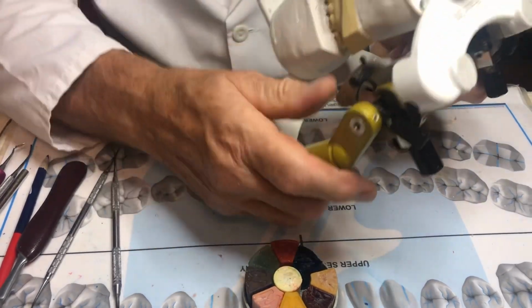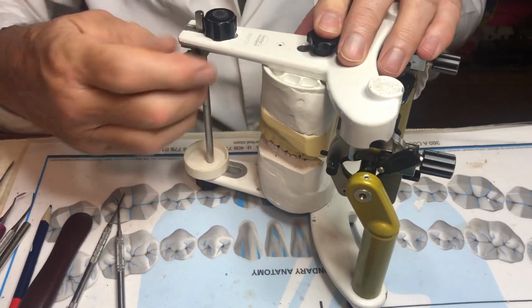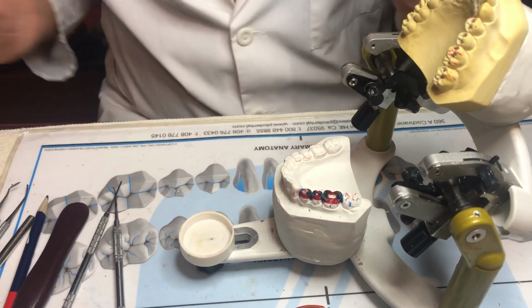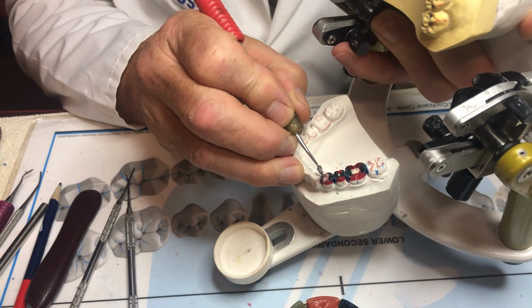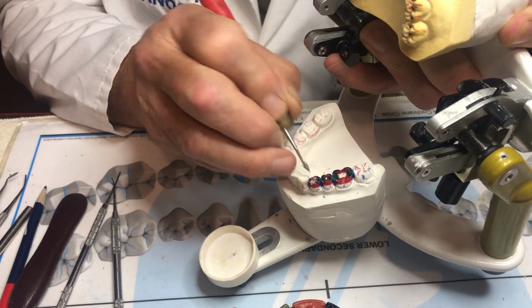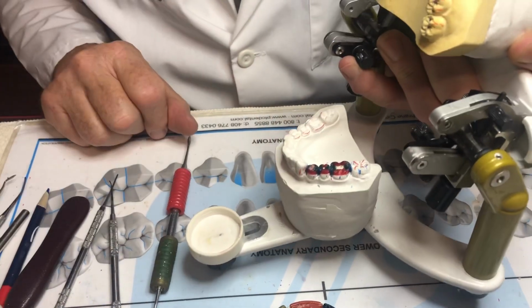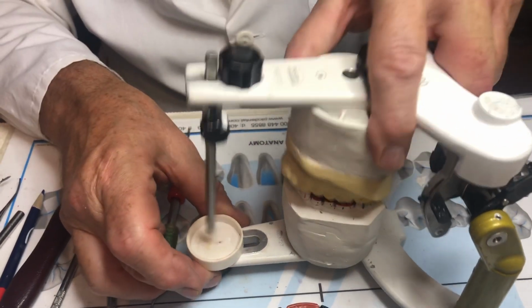Close the articulator, centric occlusion, move it in working, balancing, protrusion, and retraction. Now I have all of that. I can switch over to whatever carving instrument I have. Take a small instrument, I can come in and accentuate the secondary grooves, triangular fossa, distal triangular, central groove, lingual developmental groove, touch up the secondaries, take my brush, tooth is finished. It's that simple if you do it correctly and you don't overdo it and you have nothing to change.